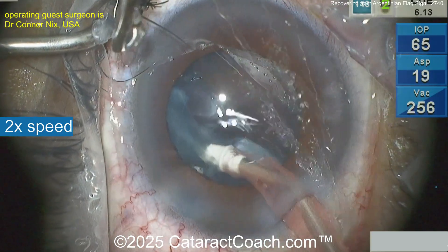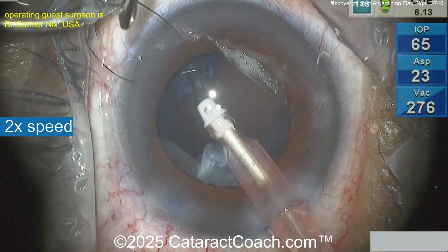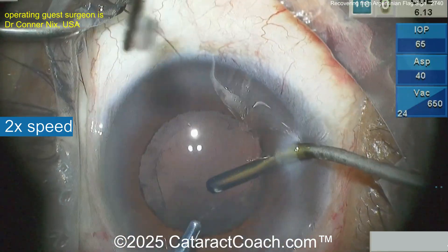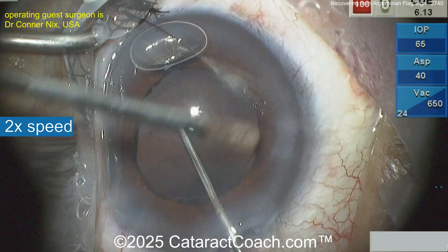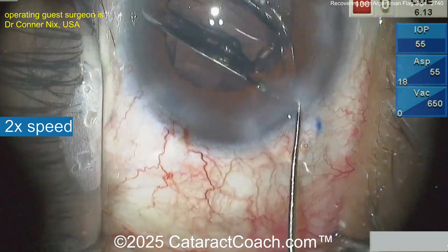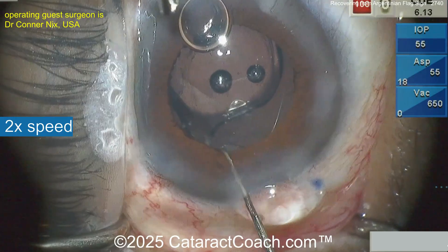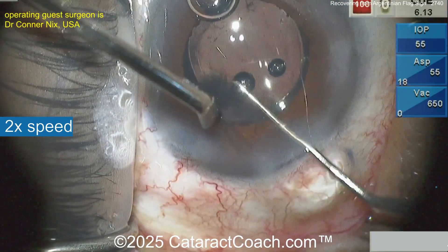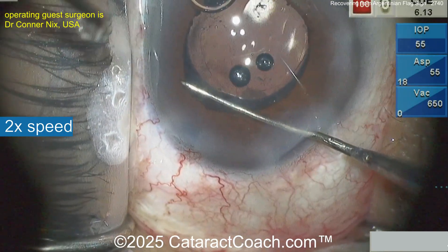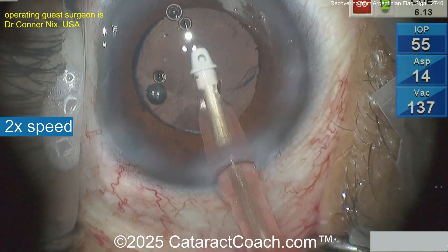They start off with almost no vision, and then anything's an improvement. You could do an anterior vitrectomy, put an AC IOL in, give them a little bit of chronic macular edema and 20/70 vision, and the patient will say 'Thank you, doctor — so much better than before.' But in this case, I think the patient can achieve totally a normal outcome. Clean up here with the bimanual IA. Filling the capsular bag with viscoelastic and now delivering the lens. Nicely done. Is this a resident case? Because in my cases when my scrub tech squirts the cannula, it's just a little farther away. Connor — are you a resident or are you attending? That's fantastic. The skill set here is fantastic — I would have thought you were in prior practice. Fantastic job. I like that check at the end, making sure the haptics are in the capsular bag by lifting the iris.